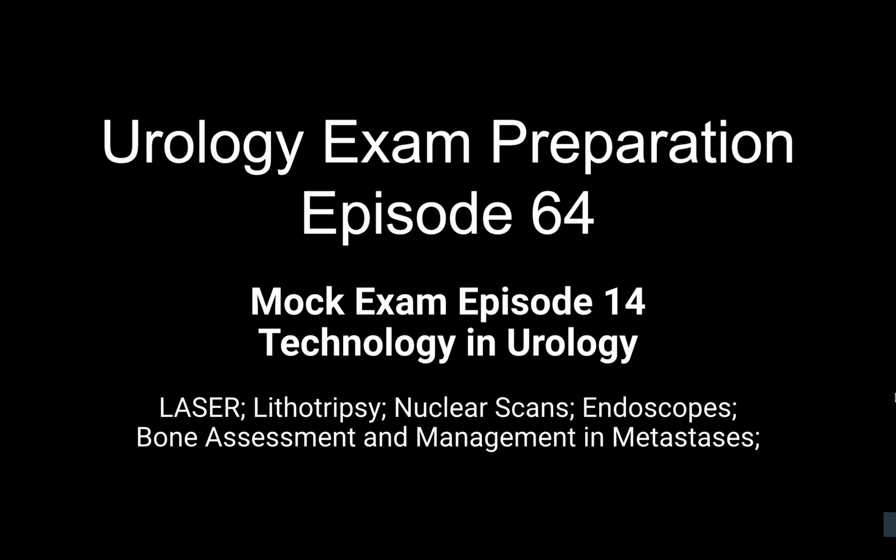Even with this, it's quite difficult to differentiate from Paget's disease. That's why the history is important. Sometimes a simple X-ray will differentiate the Paget's disease findings and even the fracture.